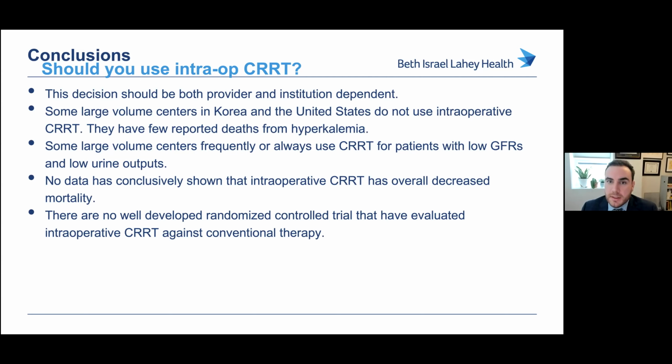Great. Dr. Mattimore, thank you very much. We got a last-minute question that just came in. In the oliguric patients, do you have a creatinine cutoff trigger for starting CVVH? No, but I really think that the 6-hour rule is very helpful.